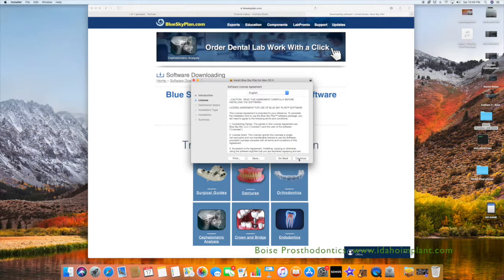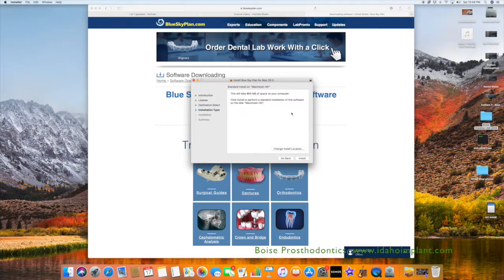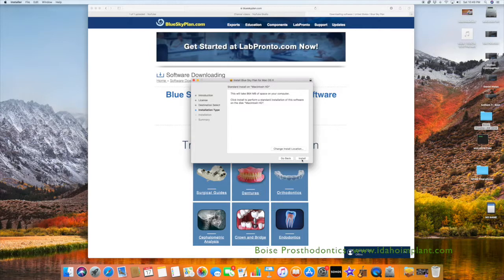So go ahead and click Continue, Continue, and you agree to the terms and conditions, and Install.